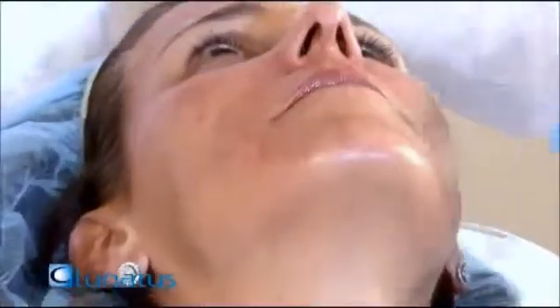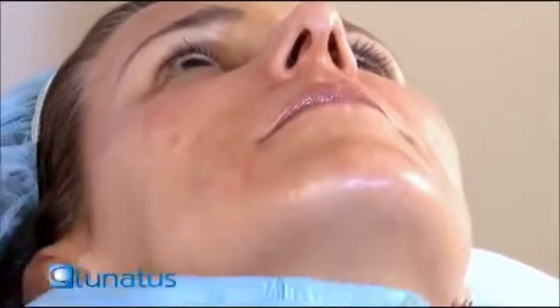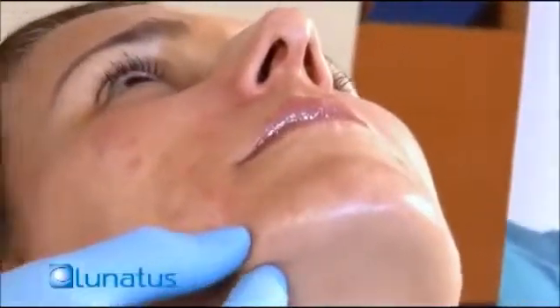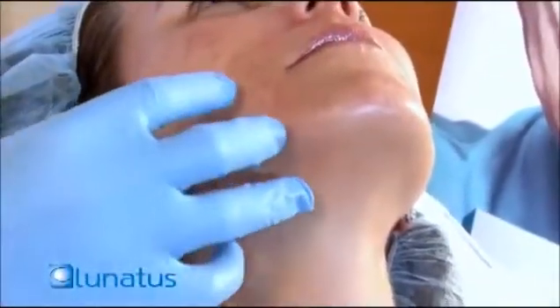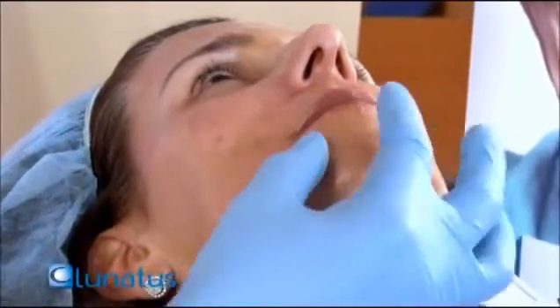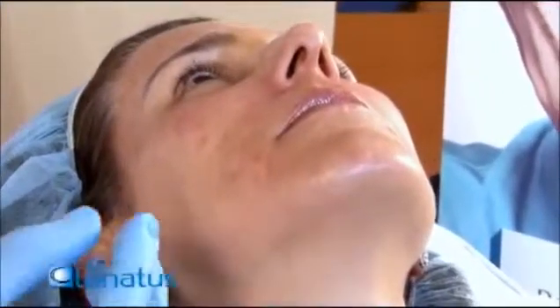Whenever I do the chin, I always like to have the neck fully exposed. I put a pillow or a folded towel right underneath the neck so I can see the full neck and identify where the defects are. She is very well chiseled since she's had this done before, so we're basically touching it up. I can see the defect right over here. This whole area belongs to the cheek compartment, going all the way down. This area belongs to the chin compartment. The pre-jowl sulcus occurs right over here and needs to be filled up a little.